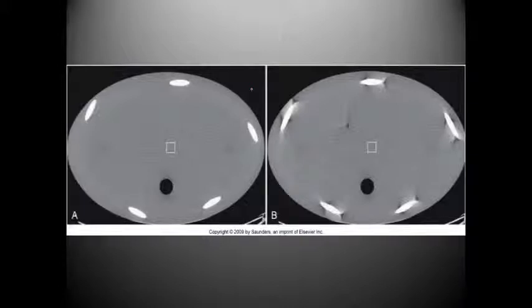So here we have cone beam artifacts on image B and the resolution of cone beam artifacts on image A. As we can see, when we get to the edges of the scan field, we have these artifacts. When we correct them, we see the nice smooth objects that should be visualized without any artifactual evidence. But notice that they almost appear as streaks, but they kind of have the band type of appearance as well. Also notice that as a result, we have this included as well.